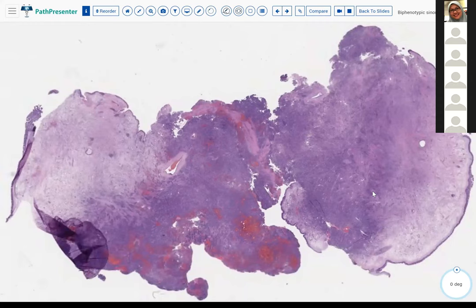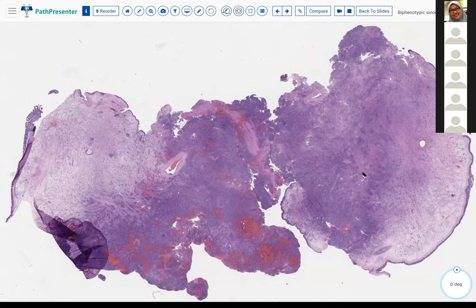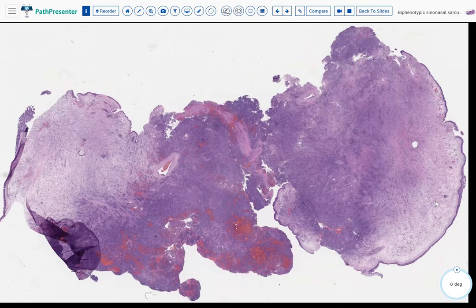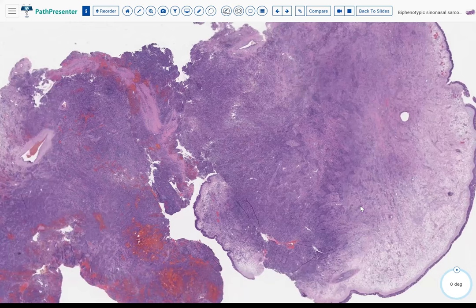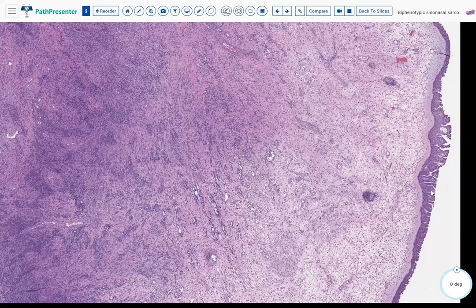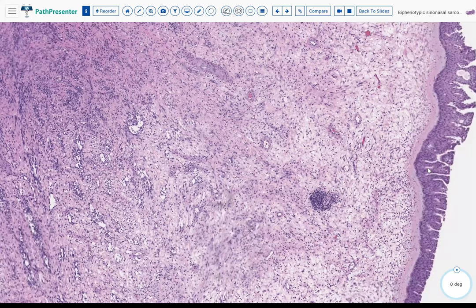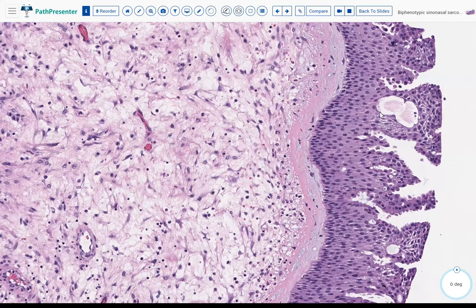This is the first case. We have an excision with areas that look very cellular and very blue from low power, and then areas that look more hypocellular. This was about a 55-year-old female and it was in the sinuses, in the head and neck area. Going to high power, we show some respiratory mucosa, which is pretty benign with no significant atypia or any premalignant features.